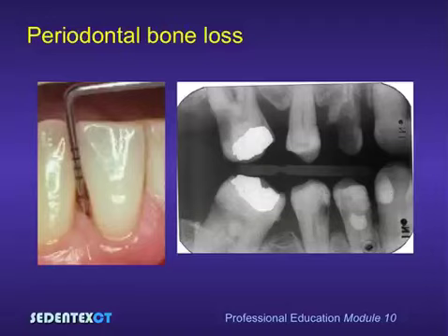Another very common task performed by dentists is the identification of periodontal bone loss. We should not forget, however, that the primary diagnostic method of identifying periodontal disease and periodontal bone loss is clinical examination, for example using a periodontal probe. Conventional radiographs can be used to give an impression of the bone loss, but this is of course restricted to 2 dimensions. Nonetheless, there is no international or national consensus on the value of radiography in identification of periodontal bone loss.